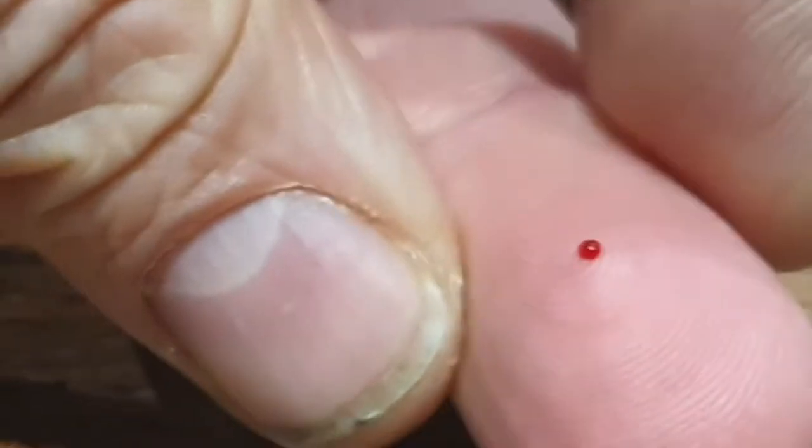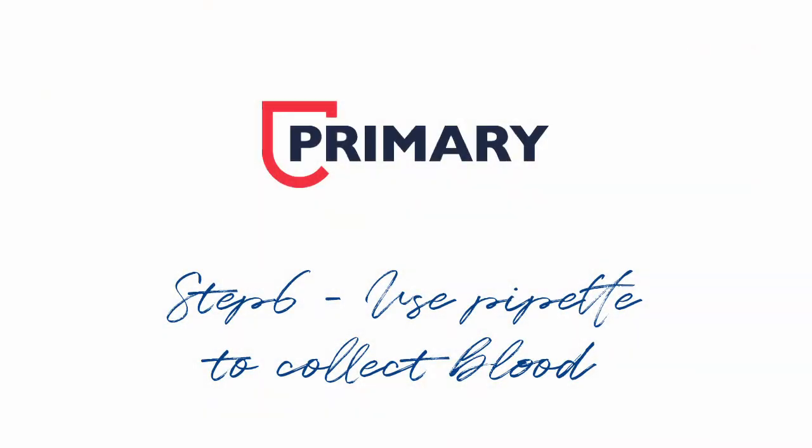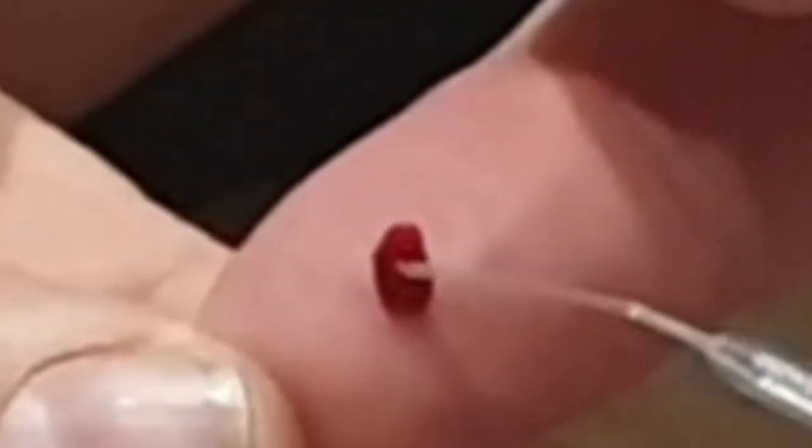Be careful not to put your fingers into the sample. Step six: use the pipette to draw up blood from the bubble. Try not to get any air bubbles in the sample, and don't suck the sample too far into the pipette.